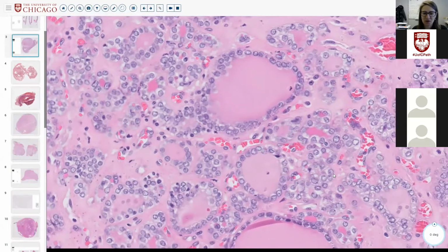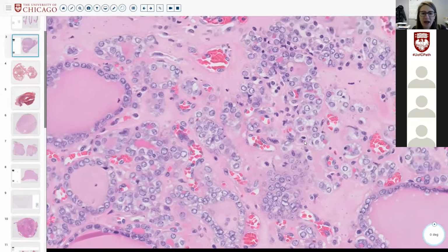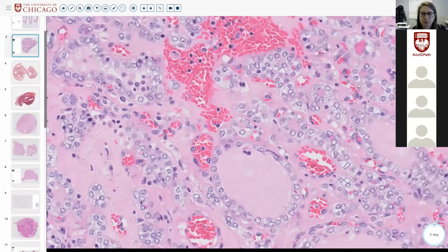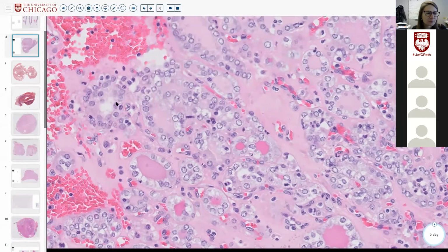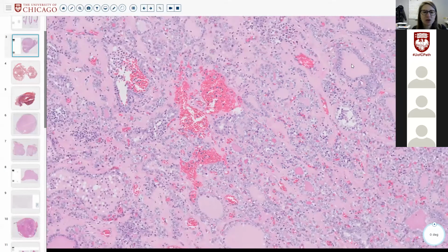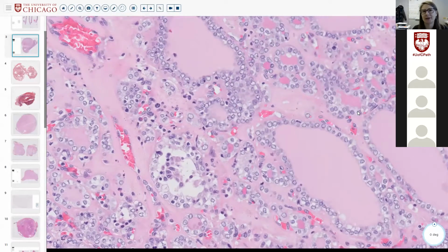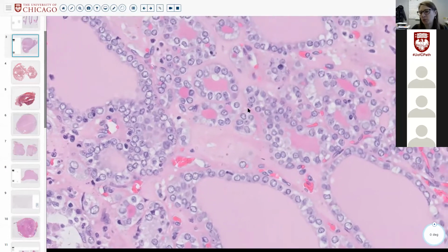They certainly don't have those weird artifactual vacuoles. Yeah, we have some papillary-like nuclear features here. We have overlapping, we have clearing. They are different than the surroundings. So I think the nuclei aren't completely cleared on resection. They have a nuclear clear ring or chromatin clear ring. We haven't eliminated all of the weird nuclear features, is what I'm trying to say, on the permanent, right?